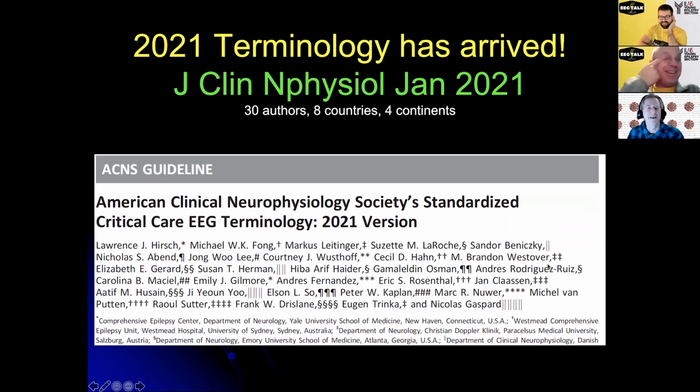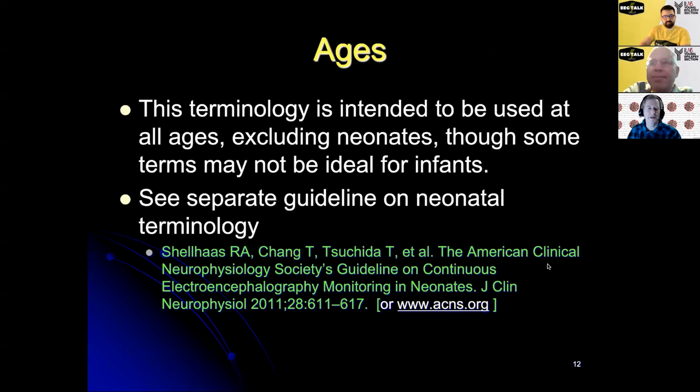And then this one added a lot of things that people asked for, like ictal-interictal continuum and to include seizures. We actually did not include a definition of seizures in the prior one. So cool. Well, teach us about it. I think we should be using this. We use this at all ages except neonates. There's a separate neonatal terminology published, but probably doesn't work great for infants.